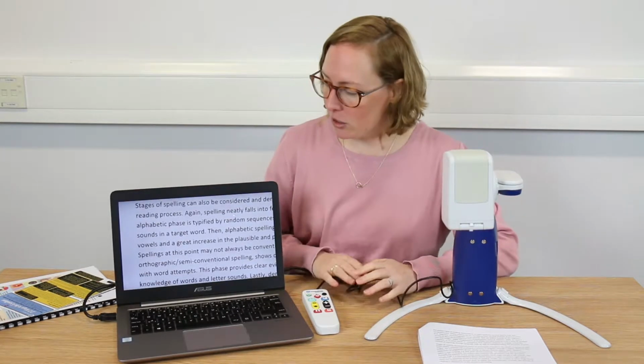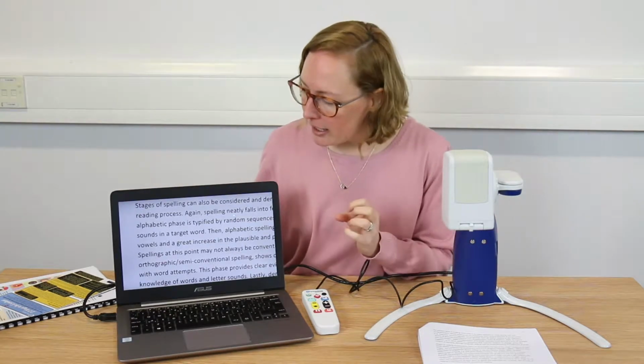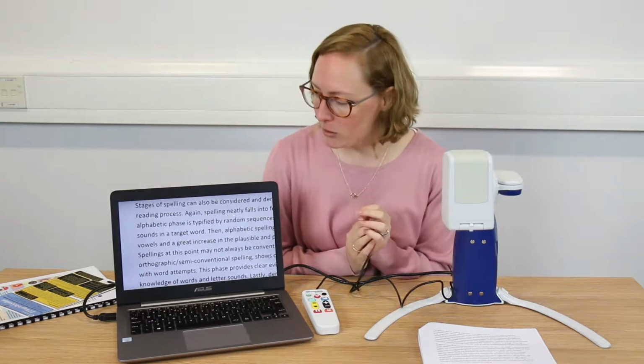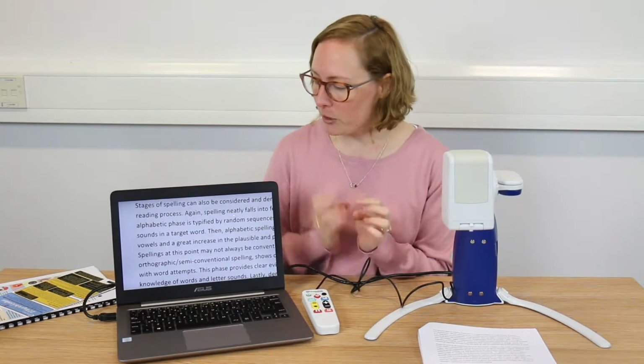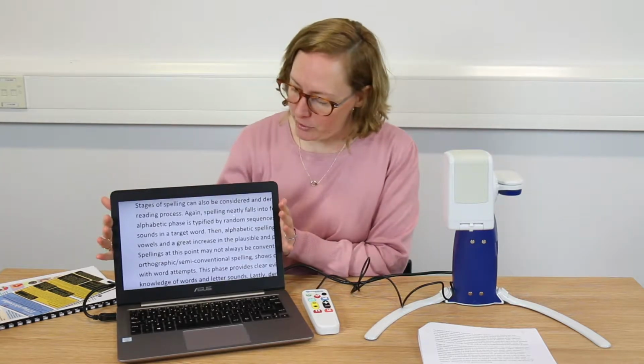You can connect to a number of devices, so a number of monitors, in order to get the image. So I've got it connected to a laptop, which is running something called the GEM software, which is what you need in order to view the image on your laptop or on any computer. But you can actually connect the camera just to a monitor if you wanted to, and use it very much like a standalone desktop video magnifier.